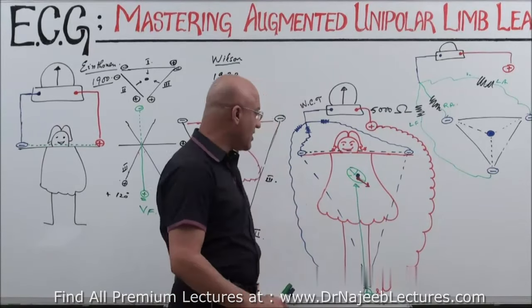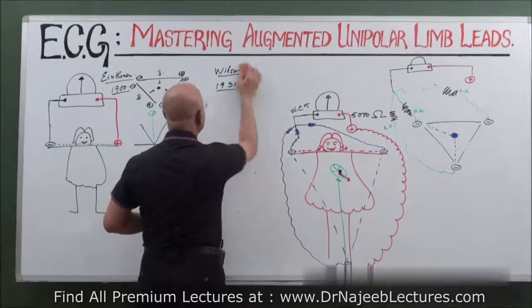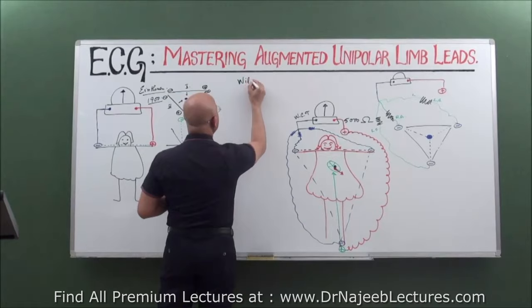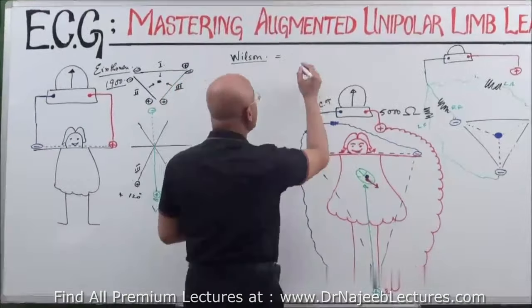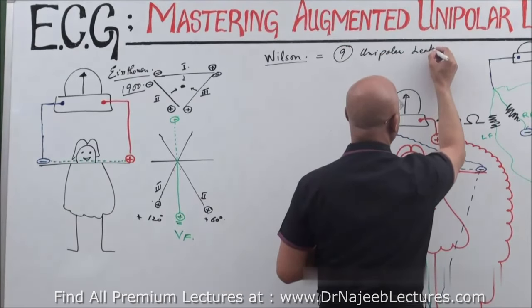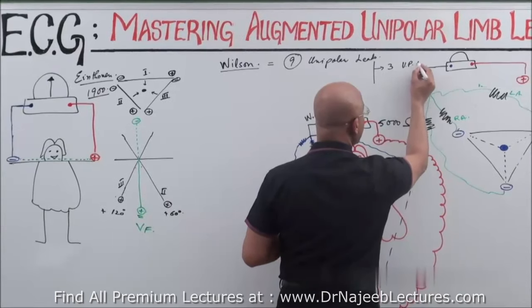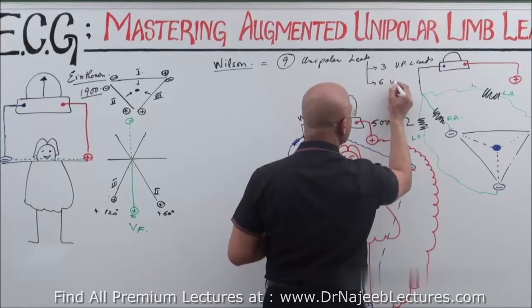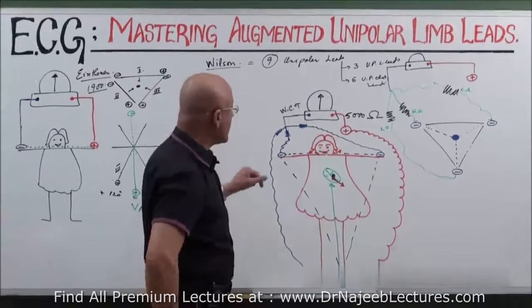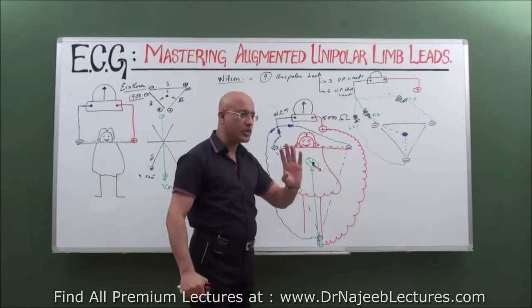You understand it? Then Mr. Wilson did other things too. Now let me tell you what else he was doing. Wilson was in the 1930s, and Einthoven in the 1900s. Wilson made multiple leads. In total he made nine unipolar ECG leads. How many unipolar leads did he make? Nine. Three of them were unipolar limb leads, and six of them were unipolar chest leads. So in the case of chest leads, we also apply the Wilson common terminal. But that I will not discuss now. That will be discussed in detail when I teach you chest leads.